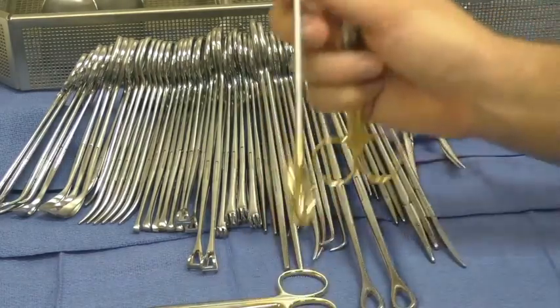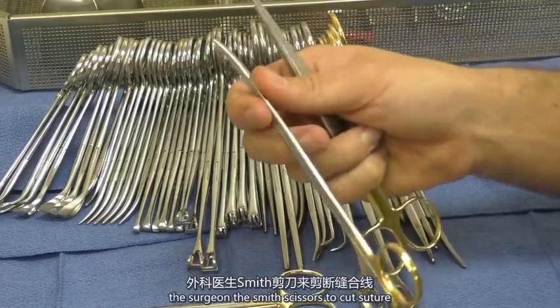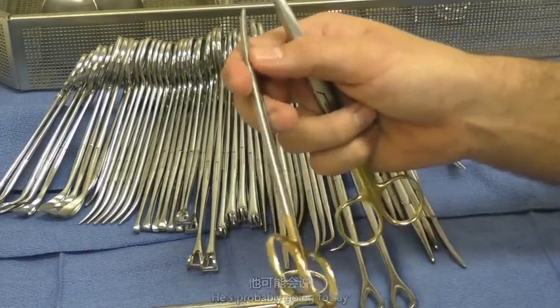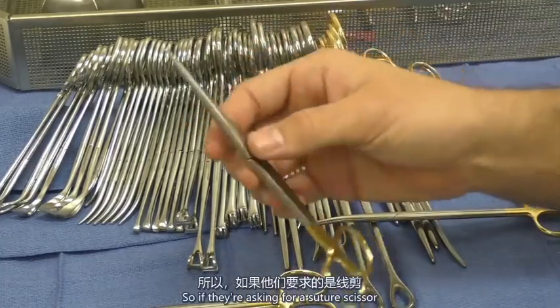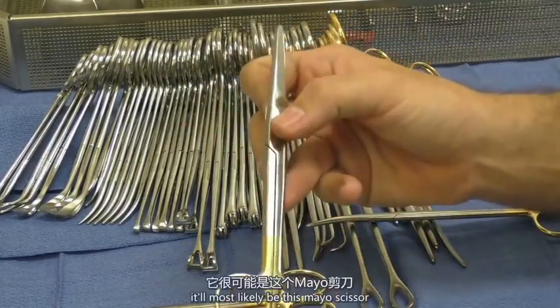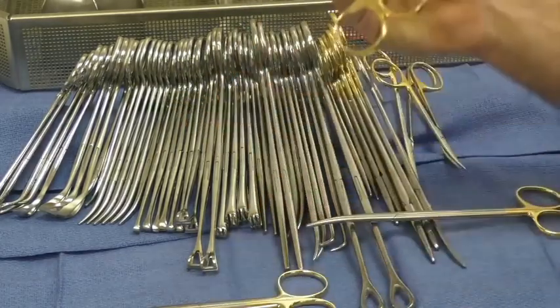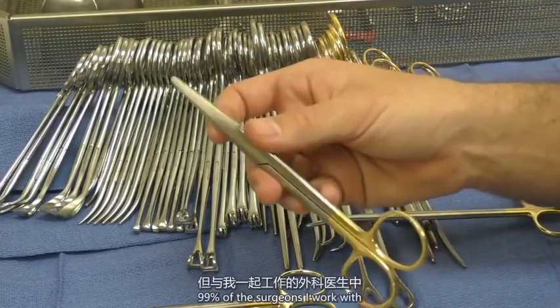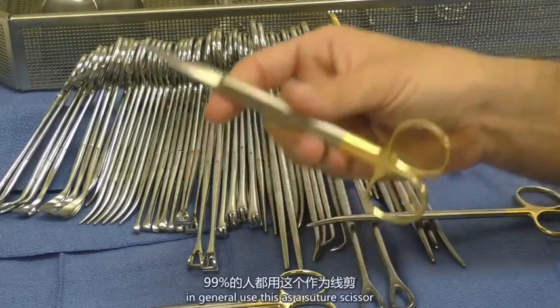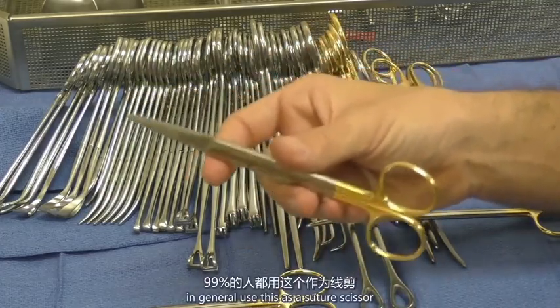If you give the surgeon the Metz scissors to cut suture, he's probably going to say, please give me the suture scissors. So if they're asking for a suture scissor, it'll most likely be this Mayo scissor. Not all surgeons are the same, but 99% of the surgeons I work with in general use this as a suture scissor.